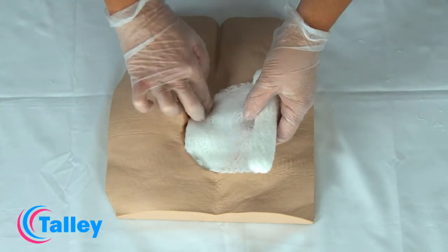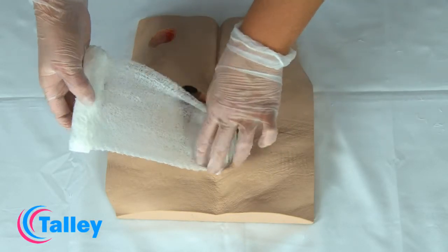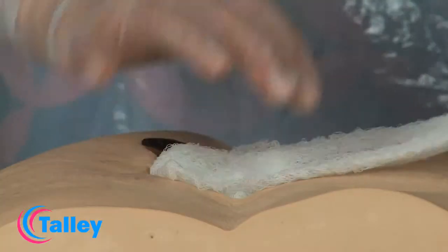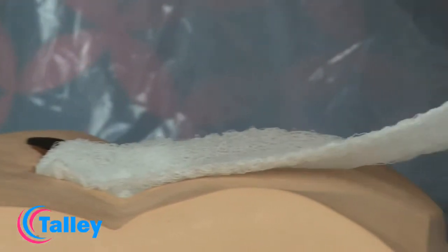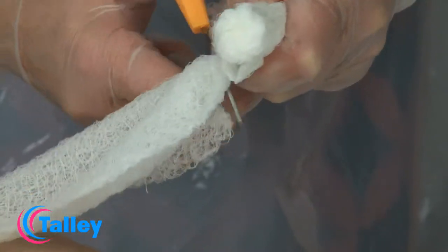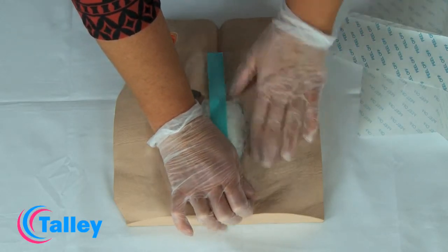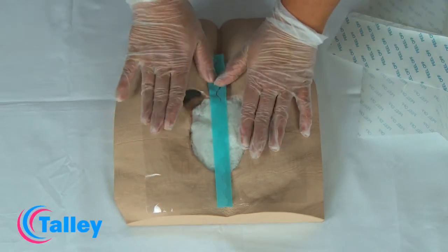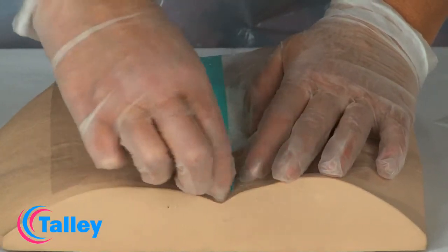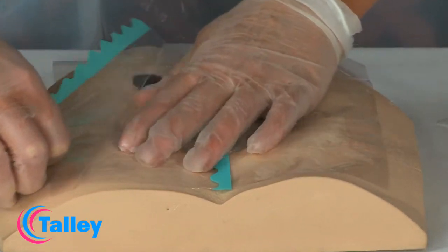The gauze should fill the wound to a level slightly higher than the surface of the skin to allow for shrinkage when suction is applied. If the wound is large, more than one piece of gauze may be required. If more than one piece is used, ensure that all adjoining edges are in direct contact with each other to ensure an even distribution of negative pressure. The total number of pieces of gauze used should be counted and recorded in the patient's notes.